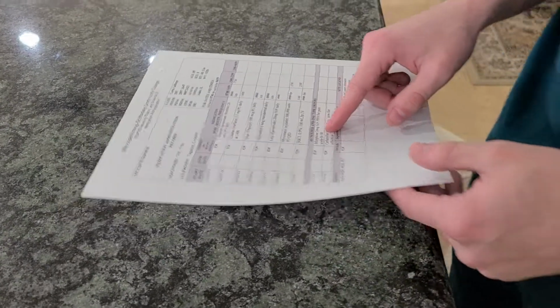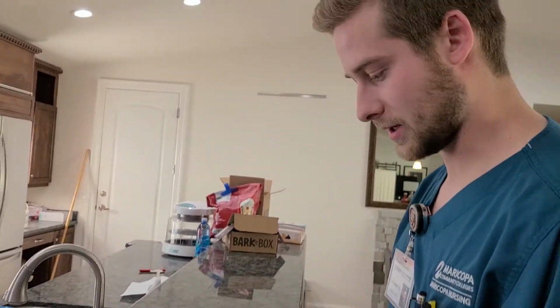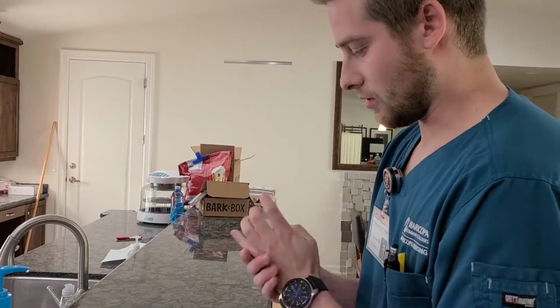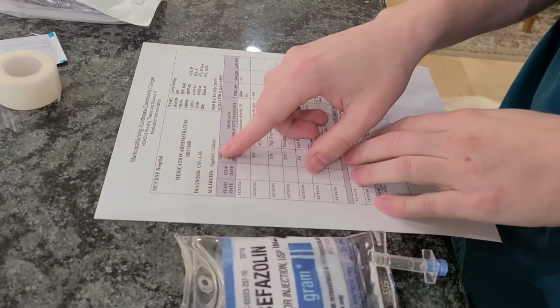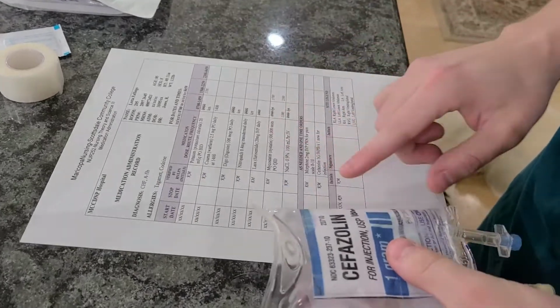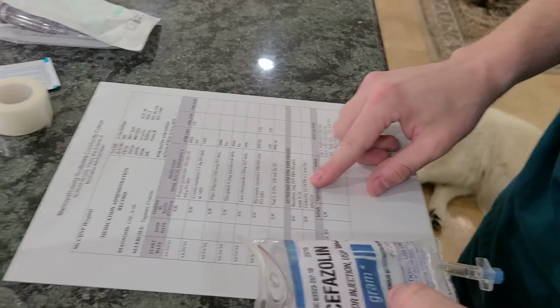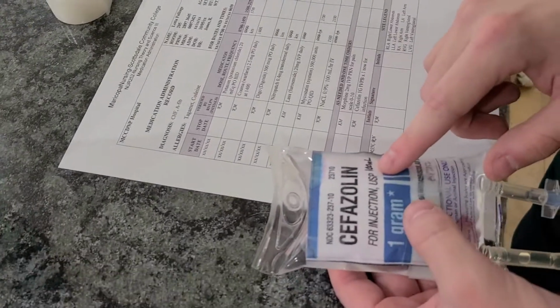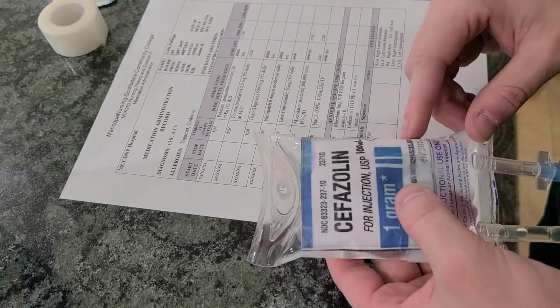So I'm going to go over to the Pyxis and drop my medication. I'm at the Pyxis, I'm going to wash my hands. I have, again, patient Lotta Fallings, date of birth 10/5XX with allergies of Tagamet and codeine. I'm going to drop the med cefazolin. I have here cefazolin 1 gram, which we have ordered, IV piggyback times 1 now for infection. I see the medication is in 100 milliliters and it expires in 2052, so it's not expired, so it is good to give.